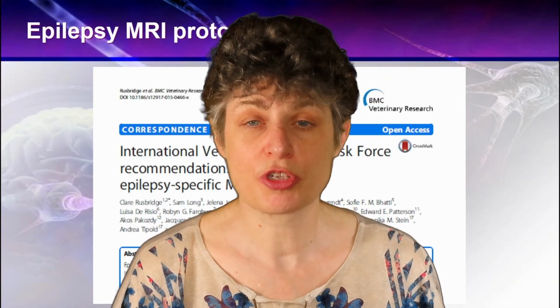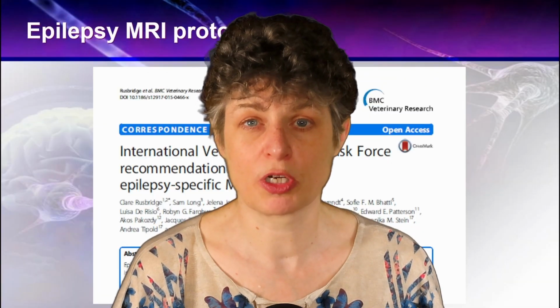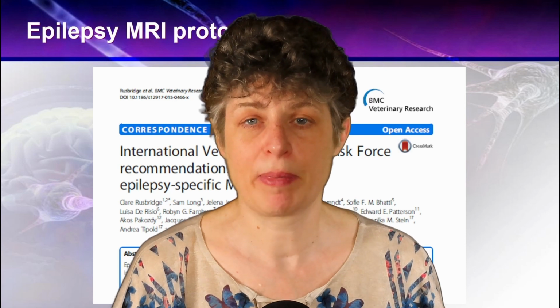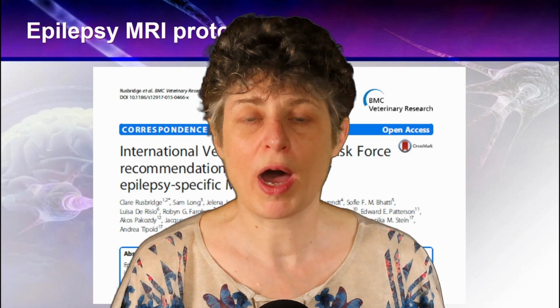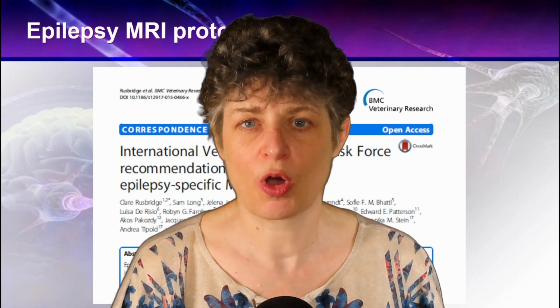So in this video, we're going to look at MRI of the epilepsy patient, why you should do it, what you think you're going to get out of it, managing clients' expectations, and also what protocol you should use. I'm going to talk you through the Veterinary Epilepsy Task Force recommendation for a protocol and why that will make more use of the MRI imaging for your patient.